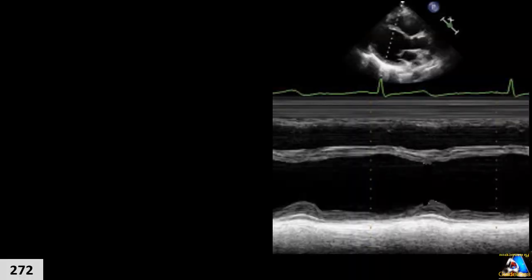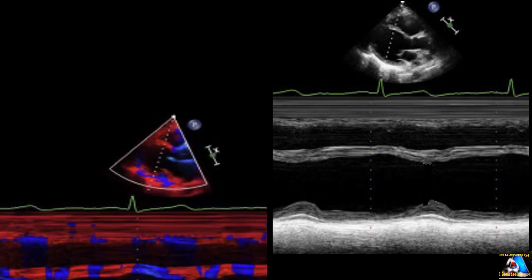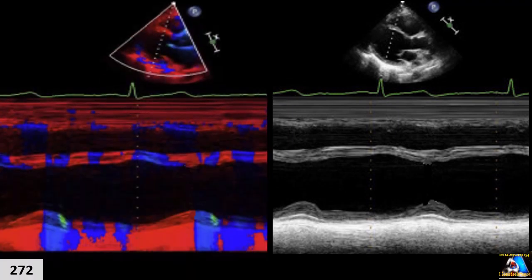M-mode is a good modality for detecting cardiac timing events. If we add color to the M-mode — called color M-mode — it improves the sensitivity and accuracy of our measurement. It is not mandatory, but if your machine has it, using color M-mode for the left ventricle will be very helpful.